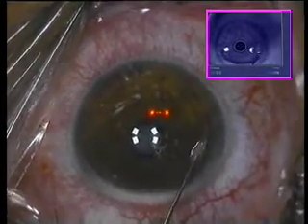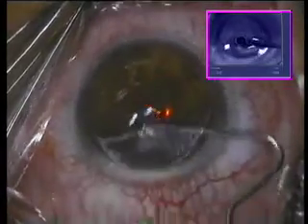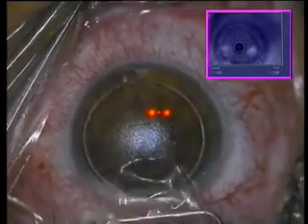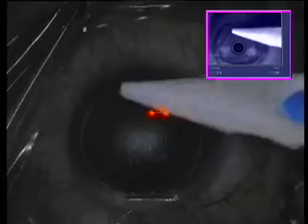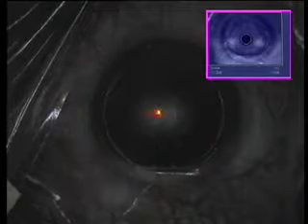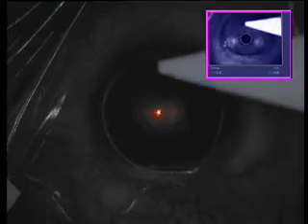Here we're going back into this right eye of the patient, preparing the flap previously created with the IntraLase, using a fine muscle hook. You can clearly appreciate how this flap appears to be de-centered towards our left on the screen, which is basically a nasal de-centration of the flap for the patient. We're going to center the Allegretto over the pupillary center, and the ablation will be driven with the proprietary software of WaveLight using eight preoperative topographies in order for the ablation to be centered over the line of sight.